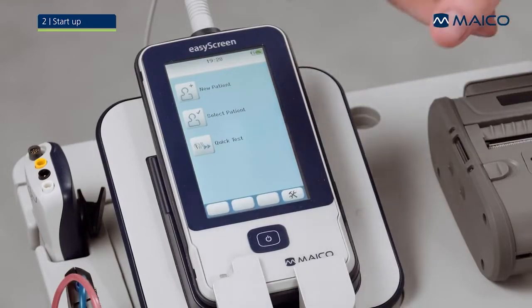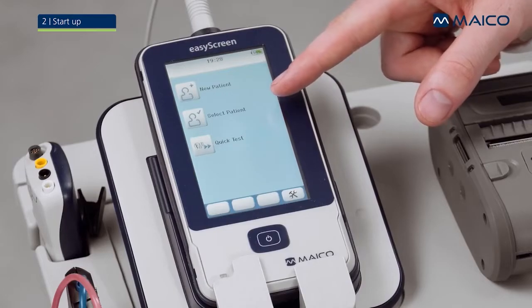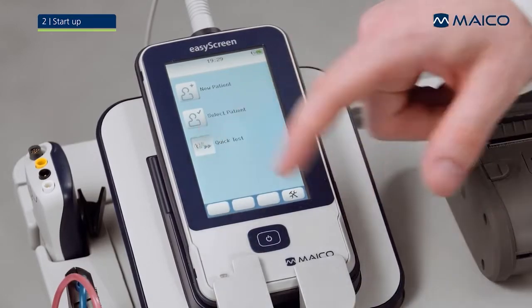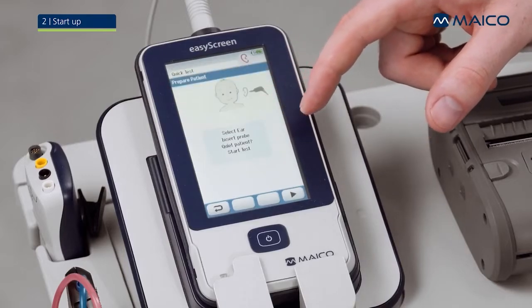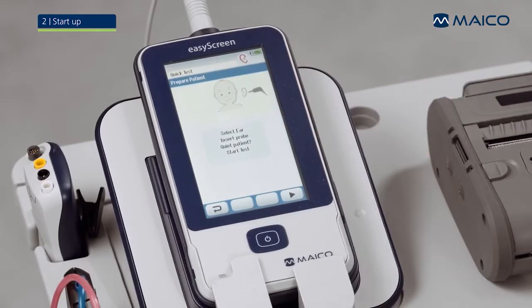You can either create a new patient, choose a patient whose information is already saved on the device, or start a quick test without entering patient information. You need to select the test method you want to execute. You can choose between TE-OAE or DP-OAE screening depending on your license. The initial test screen shows you what to pay attention to before starting a test.